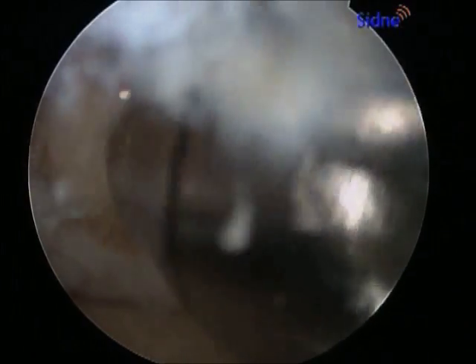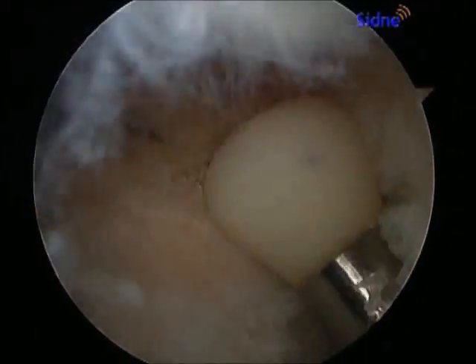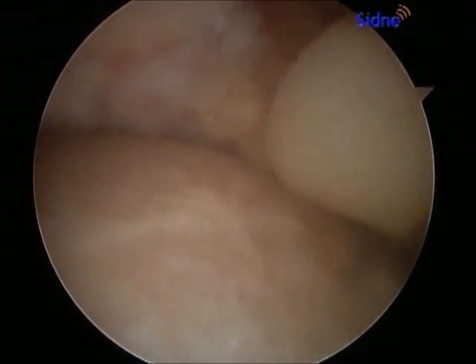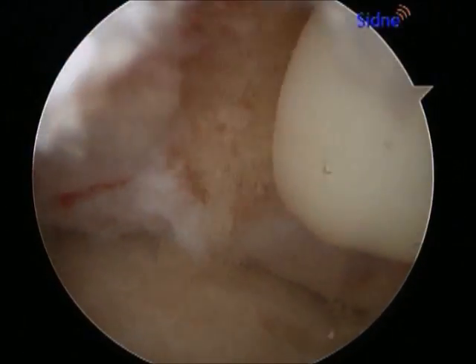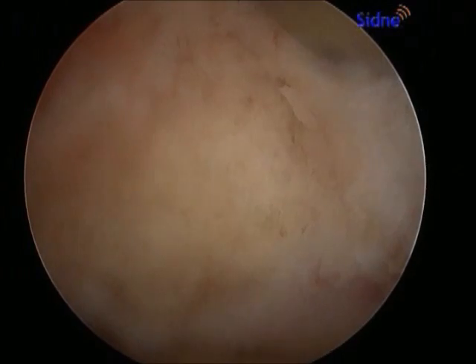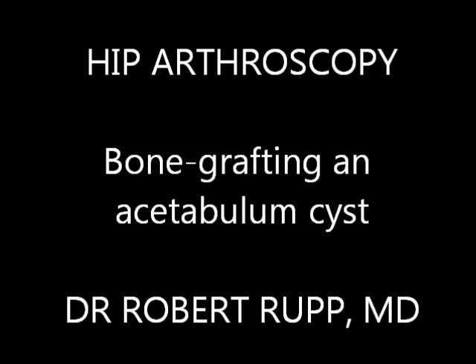Any fragmentation or loose bone in this area can be scooped up and pressed into the cavity opening of the cyst with a blunt white-tipped instrument, and these bony fragments are the final completion of the grafting of the acetabulum cyst. After this bone graft is compressed with further impaction, it becomes very stable. This is the final appearance of the stable, compacted grafting of the acetabulum cyst, and this is one way of treating early hip arthritis that has developed or caused a large acetabulum cyst.